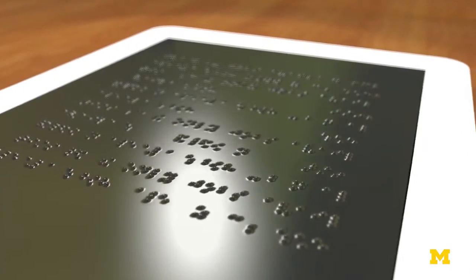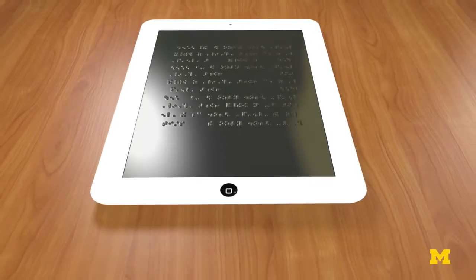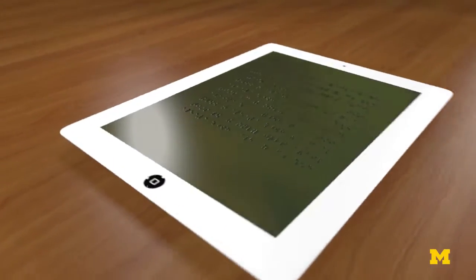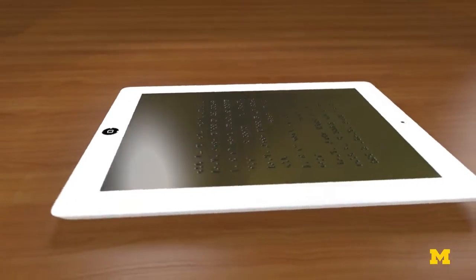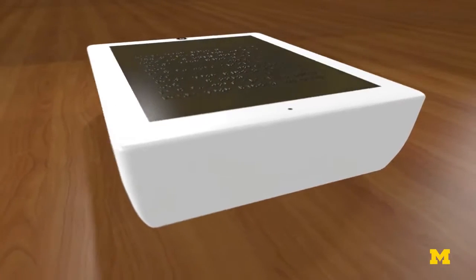Let's say you want to create a full page of braille, which is what we're intending to do. The thing that's been the difficulty is how do you control all the features that you're creating? That could be anywhere from 5,000 to 10,000 dots. So now you have 5,000 to 10,000 valves that you need to control on and off. How do you create such a device that has that many physical control features without it being so large that you can't carry it around?